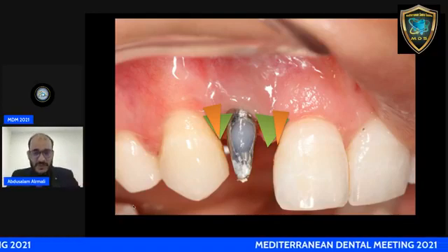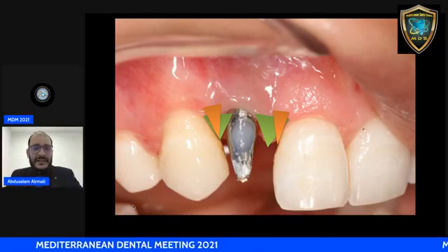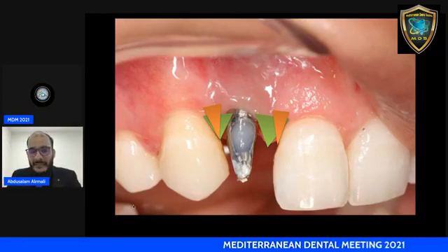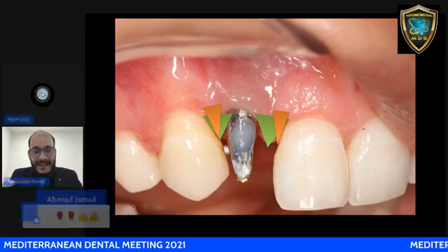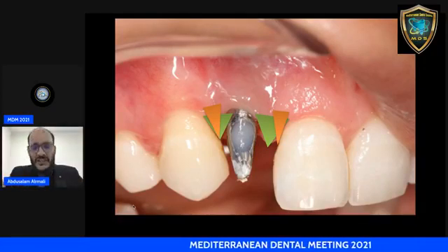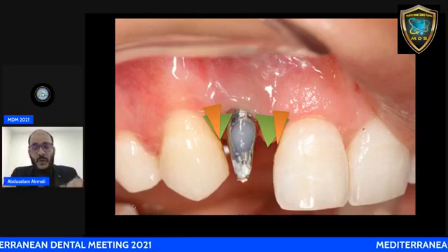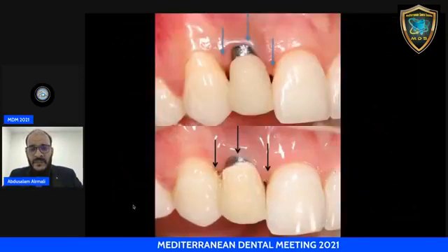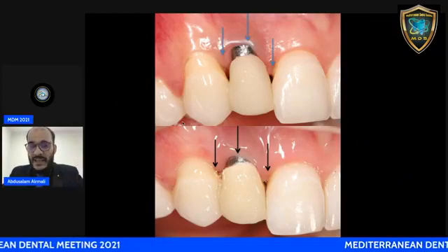With this very simple step, just changing the crown, changing the abutment, opening the embrasures, keeping the crown away from the gingiva, you give the chance for the interdental papillae, mesial and distal, to creep and form and improve in thickness and height, because this will give you the support for the coronally advanced flap, for the surgical papilla. If you don't have good interproximal soft tissue, your flap will not stay in position, and flap dehiscence and failure is reported. That's why we start with this soft tissue dehiscence away from the crown.